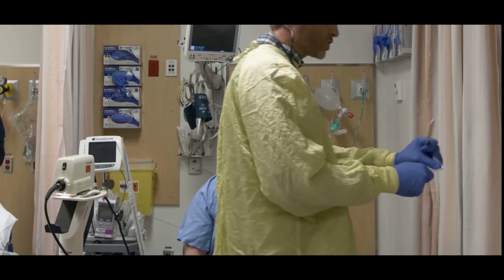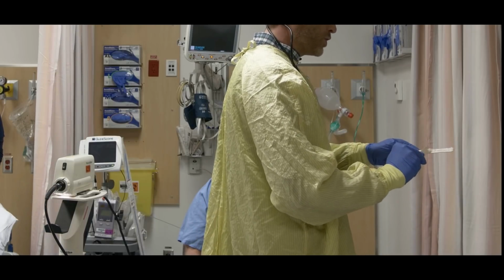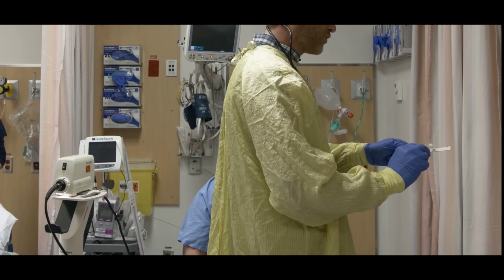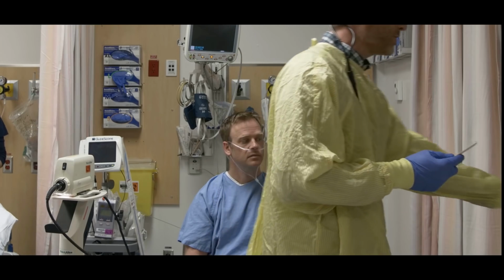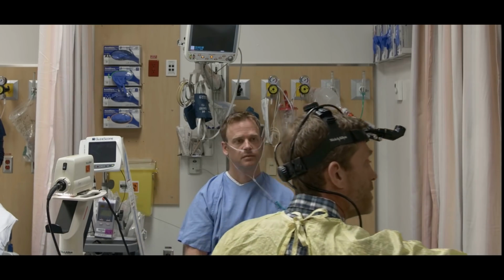And we're going to start to massage that into the tongue. Specifically, the posterior part of the tongue. The anterior part of the tongue is fine. You can touch that all you want. You're not going to induce any kind of gag reflex. So I'm going to come in here.